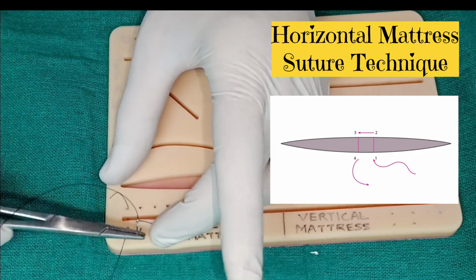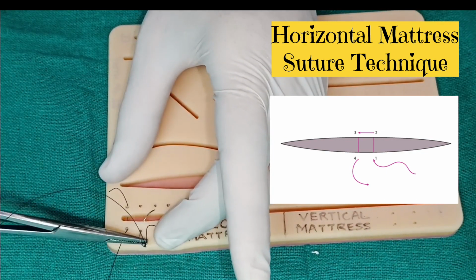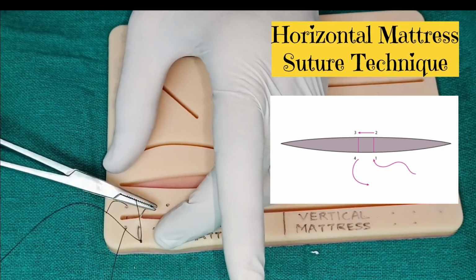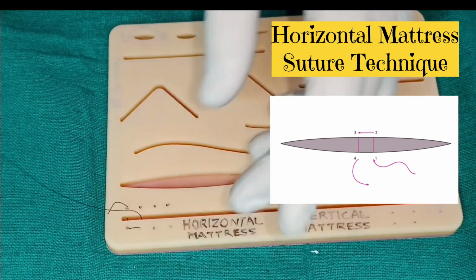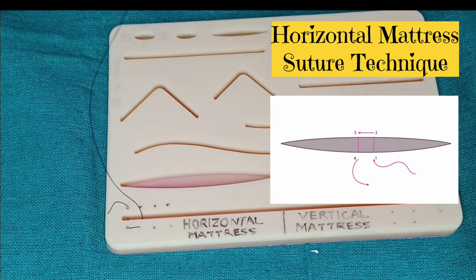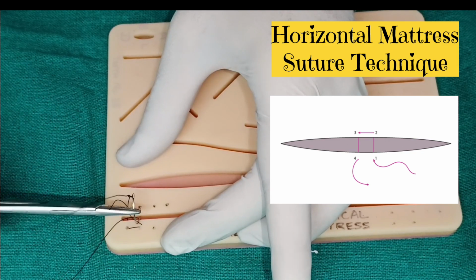Now place the second pass beginning on the same side of the laceration and inserting the needle 0.5 cm next to the exit site of the first pass.